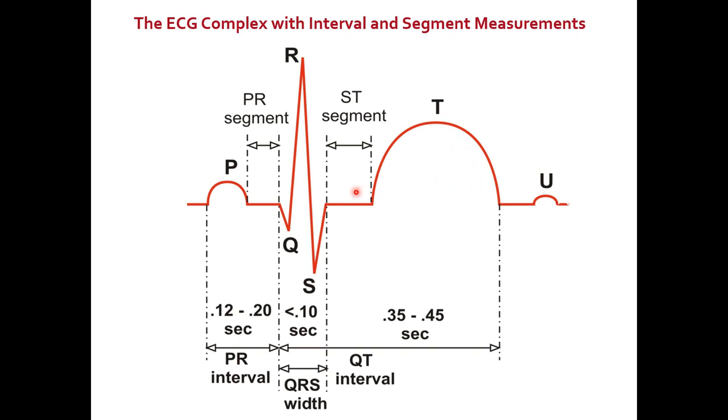This ST segment, dear, is of great importance. It can go up or go down. If it goes up, this is known as elevated. If it goes down, this is known as a depressed ST segment. Now this is very important. We refer you back to the lecture on acute coronary syndrome, in which full details of the current guidelines on ST depression and elevation are available.